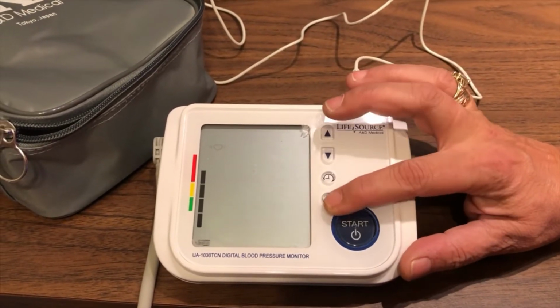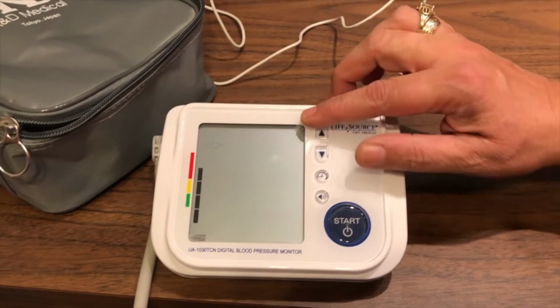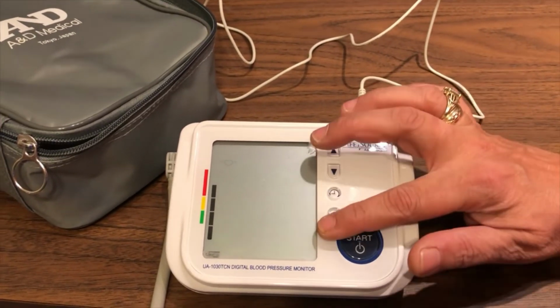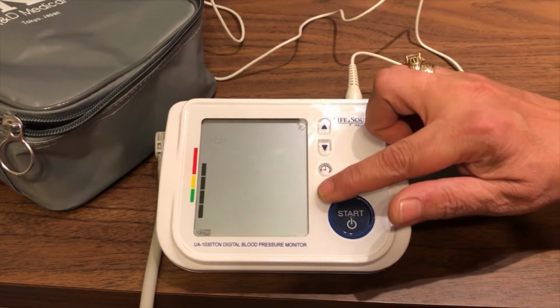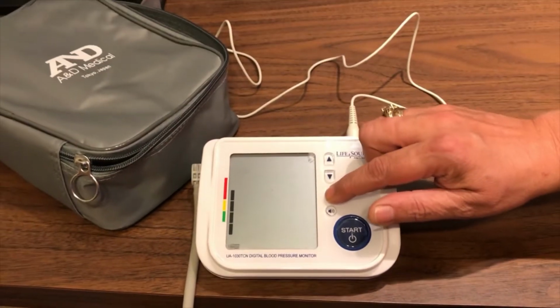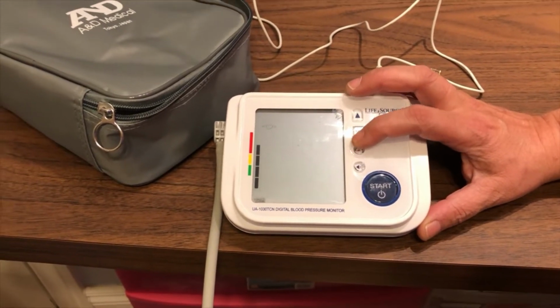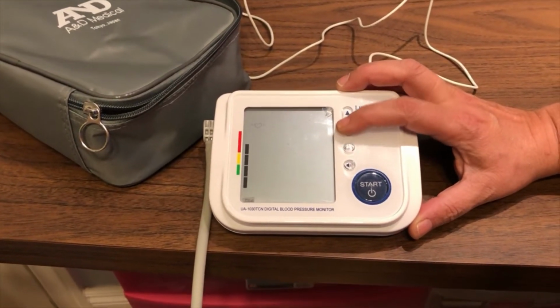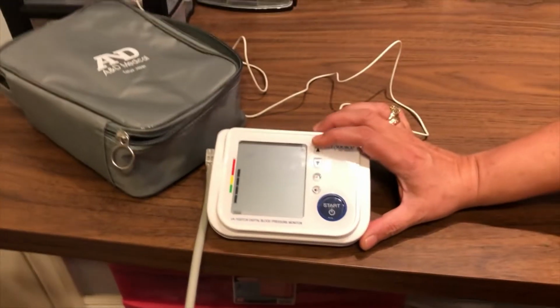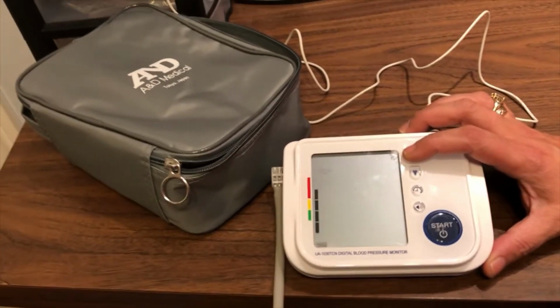Now, there is a clock button. It's the second button from the bottom. So I said these are 4 buttons going vertically. The last one was what we just did. The second one is your clock. But no matter how much I press it, it does absolutely nothing. It may do something manually, but it doesn't do anything for me. I can't read the screen. So forget the clock. You might get a sighted person to do that for you. Personally, I don't care about the date and the time because I jot things down on my phone or in a book or whatever.